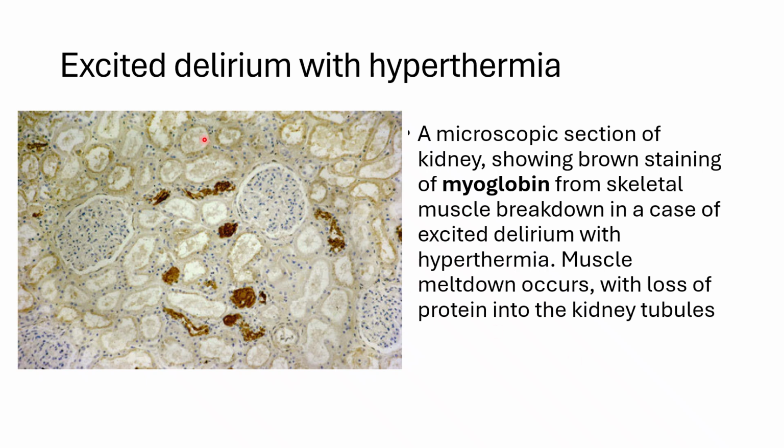So this is a case of excited delirium with hyperthermia. Here we can see the myoglobin that is present due to skeletal muscle breakdown in excited delirium in hyperthermia cases.